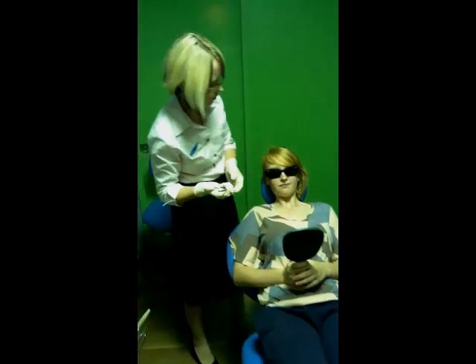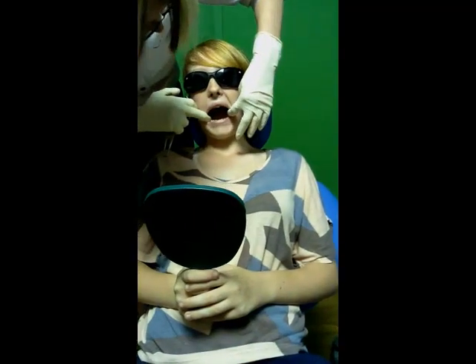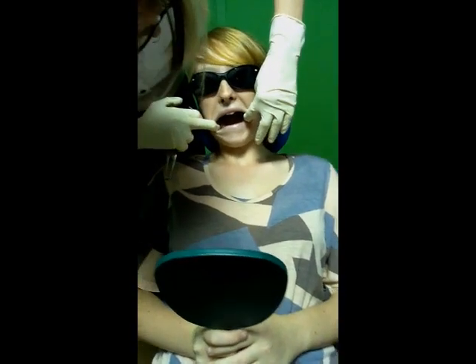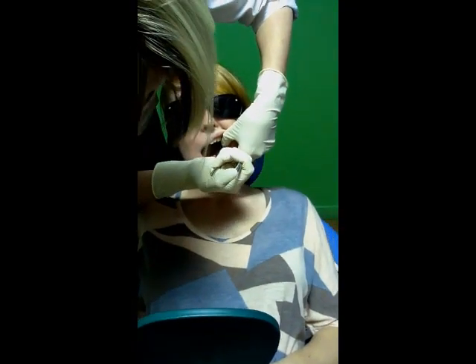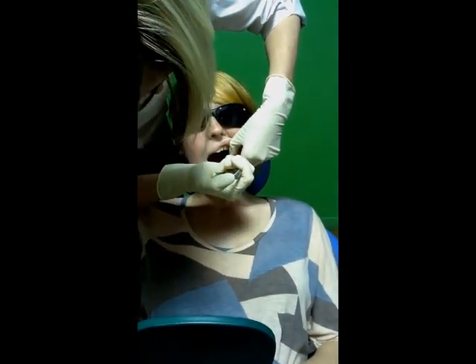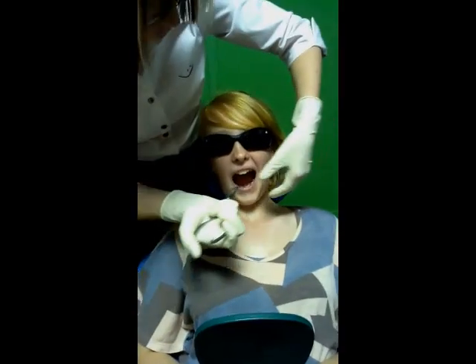So we're going to start on the bottom ones first. If you open as big as you can, we'll just have a look at which ones we're going to — we're going to these back ones. You've had your baby teeth out too, I see. Very good. So I'm going to start on this side first. It will feel tight, and you'll just feel it slip between the two. Did you feel that there? Just a little. Does it feel strange? Yes. Can you feel it when you bite together? Yes. It feels a bit like you're chewing on a trampoline or something.